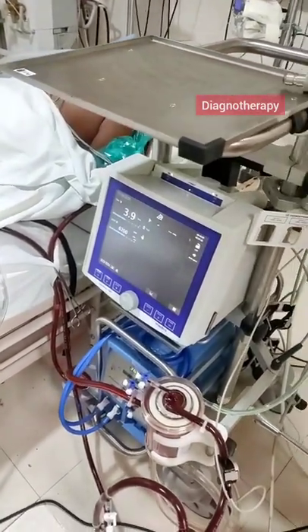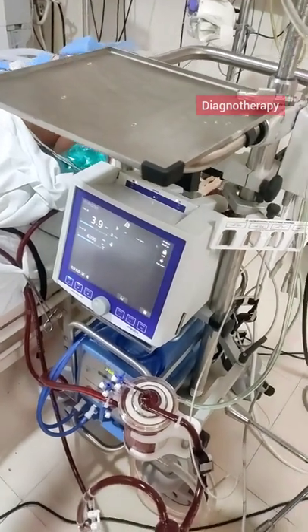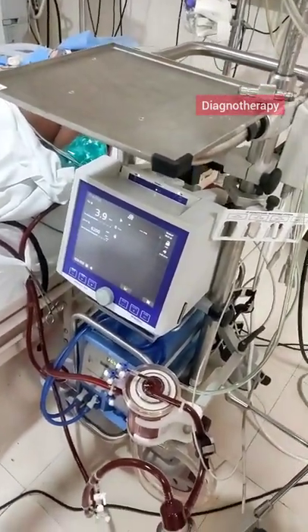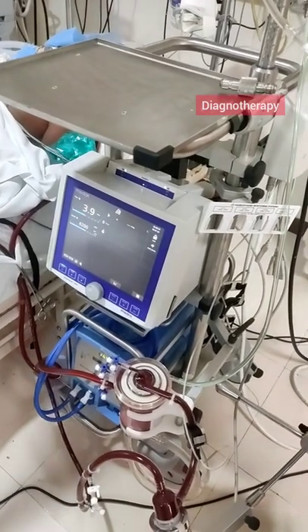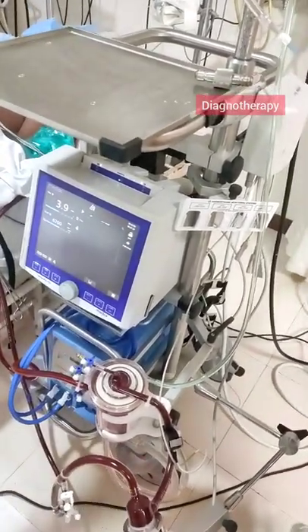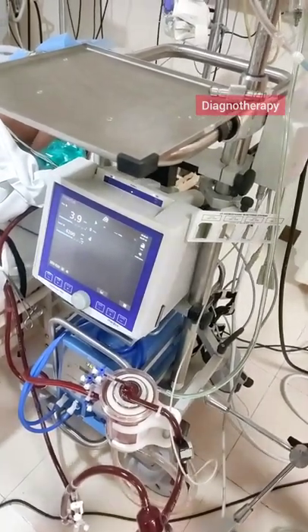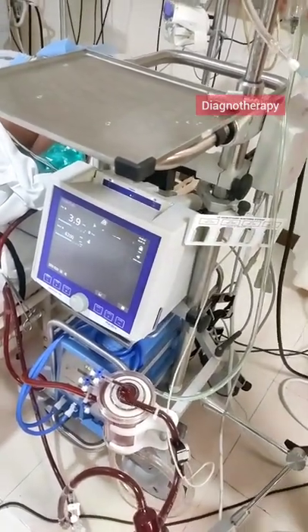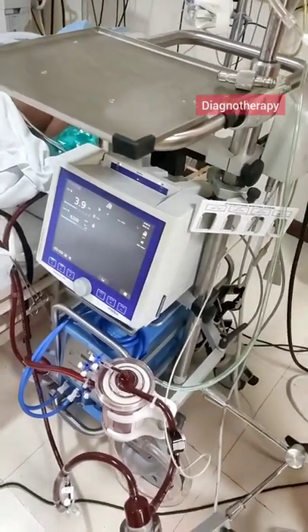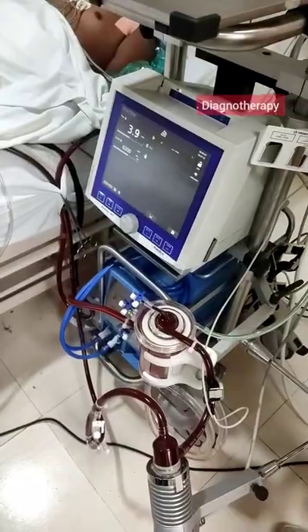The technicians carefully monitor the patient monitoring system. They monitor the different arterial pressures, SpO2, and ECG. All the vital parameters are noted, and if there is any variation or changes, decisions are made about whether any drug or infusion needs to be added. The vital parameters are carefully monitored.